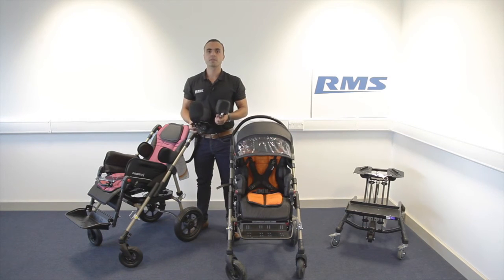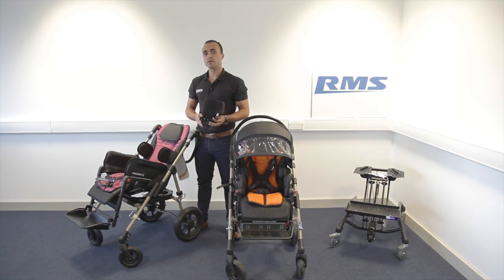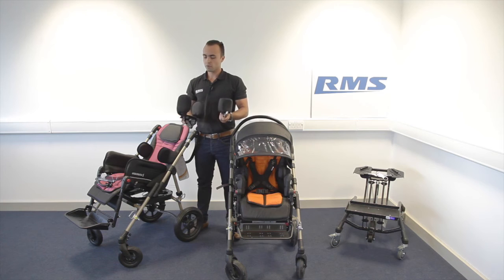We have two sizes: size 1-2, the smaller one, and size 3-4, the bigger one. There is a full range of accessories — a few here with me — and you can check online on our site for the full range of Ormiza accessories.